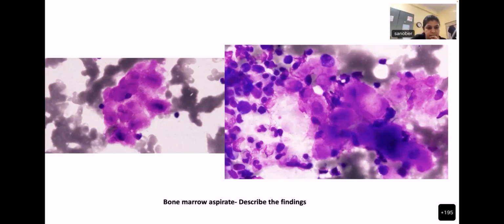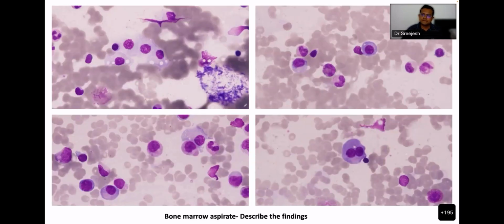Don't jump and say it's amyloid. This is a pink amorphous, hyaline material. Mostly acellular, isn't it? The cells are sticking out at the sides. It's a pinkish, amorphous and acellular material, isn't it? Okay. Yes, sir. And here, what are these cells?